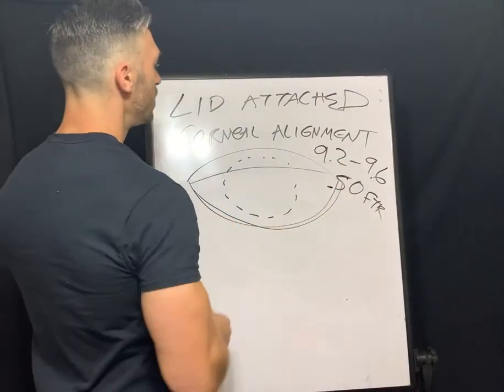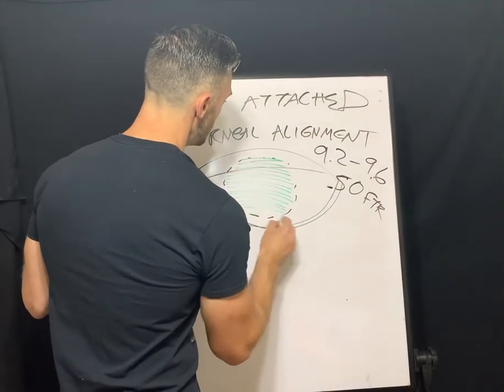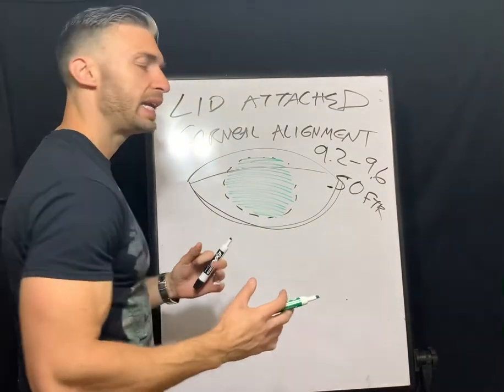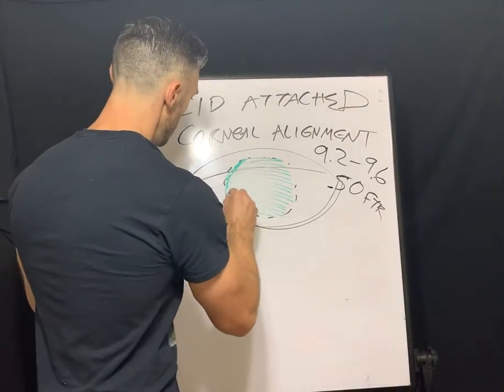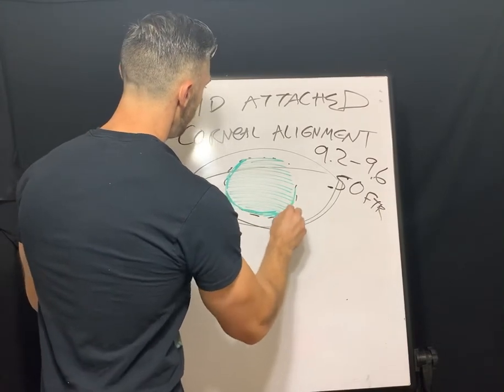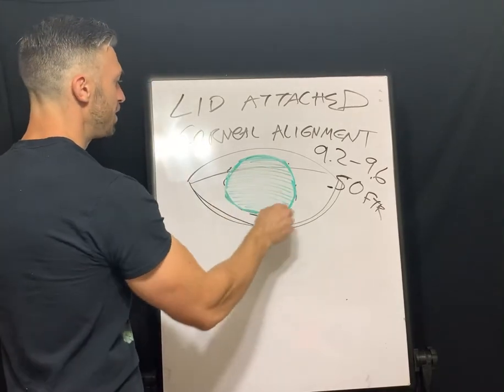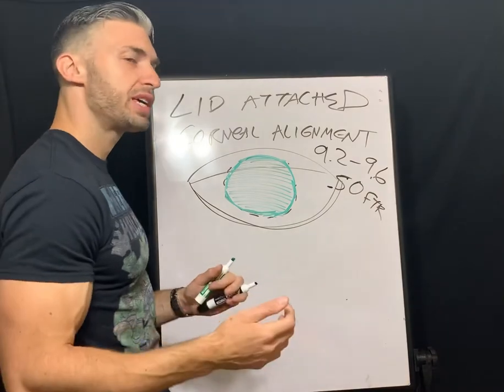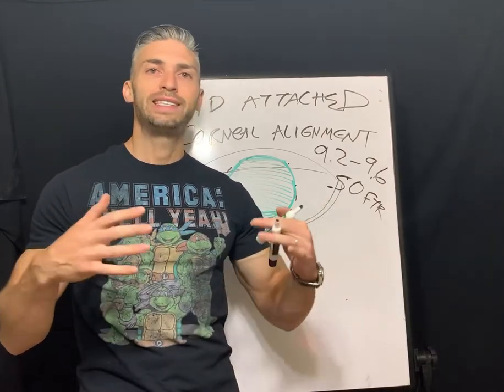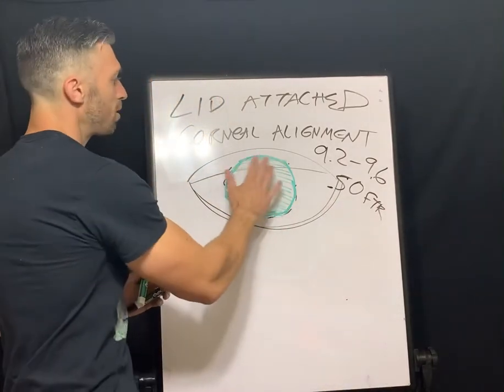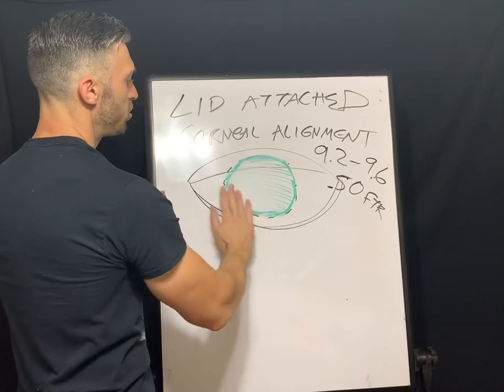With the fluorescein pattern for corneal alignment, you want a very consistent, light fluorescein pattern throughout — no excessive pooling anywhere and no excessive bearing. You still need about one millimeter of edge clearance around the periphery, even and consistent. If the edge clearance is too thin you could see blanching, which means it's too tight. Good tear exchange is essential.